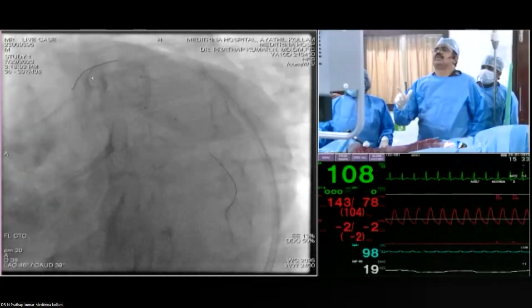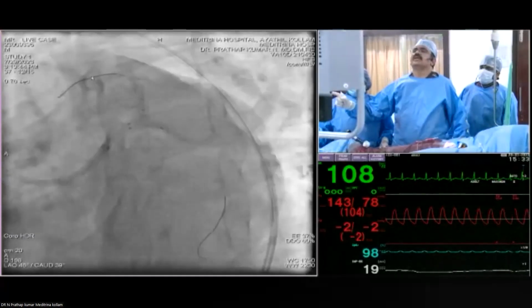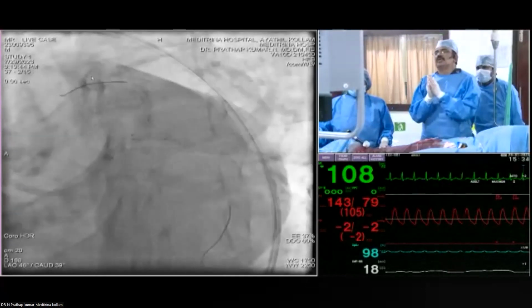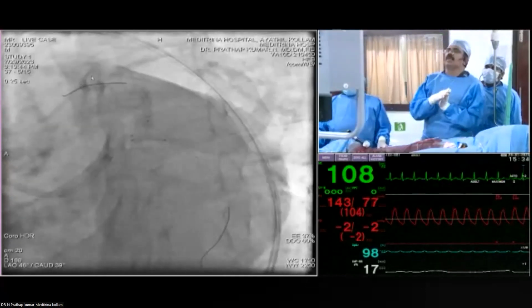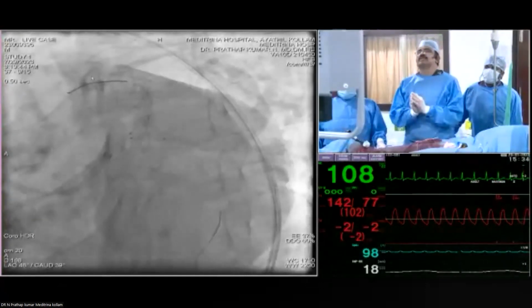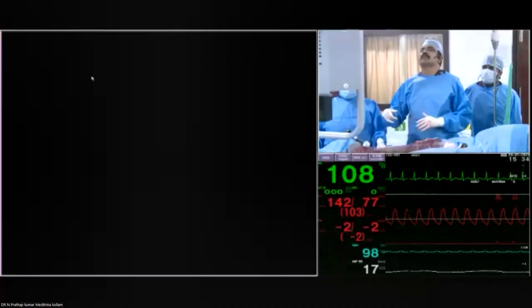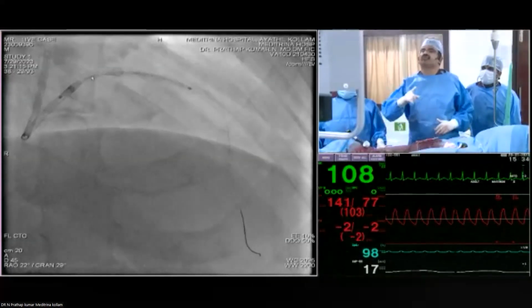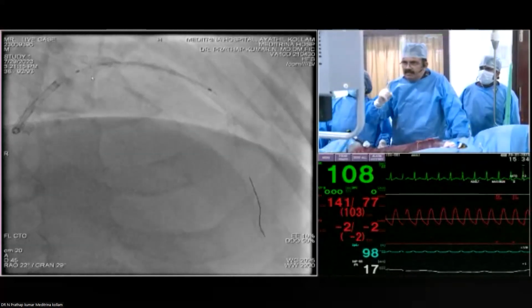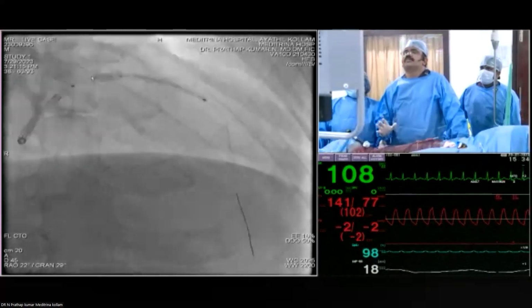It's a 3.5 millimeter balloon, which is already used for the pre-dilatation. So the proximal strut is used. Now there is a 4 millimeter balloon in the LAD and a 3.5 in the circumflex, and with the kissing balloon, deflate. Next, after that, we have taken a 3.5 by 48 stent. The stent is going inside. There is a little difficulty, but I could take the stent down.